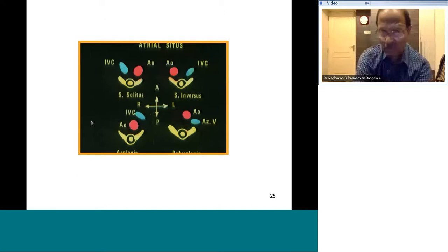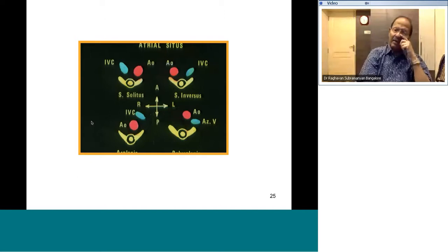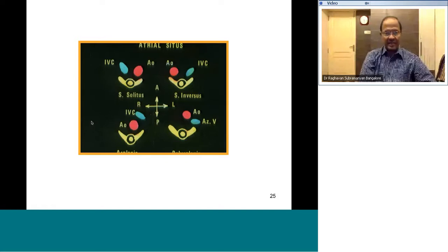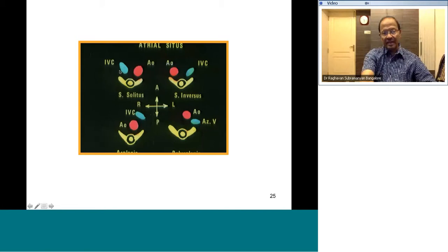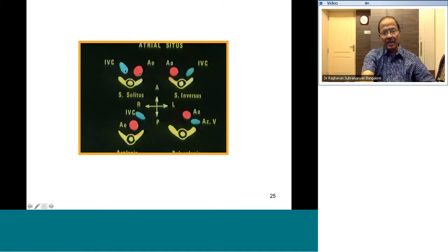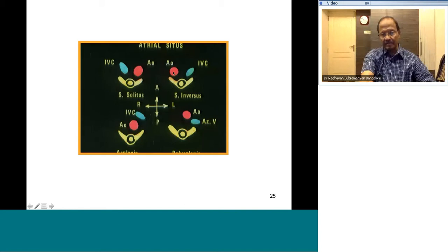Abdominal cross-section echo also helps identify visceral situs and indirectly atrial situs. Normally, the aorta lies on the left side of the spine and the IVC on the right side, both in front of the spine. In situs inversus, the aorta is on the right side and the IVC on the left — they remain on opposite sides at the same level. You can apply colour Doppler to confirm: IVC shows flow toward the heart, aorta shows flow away from the heart.